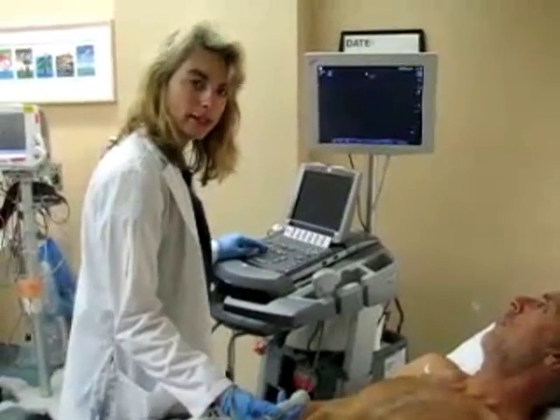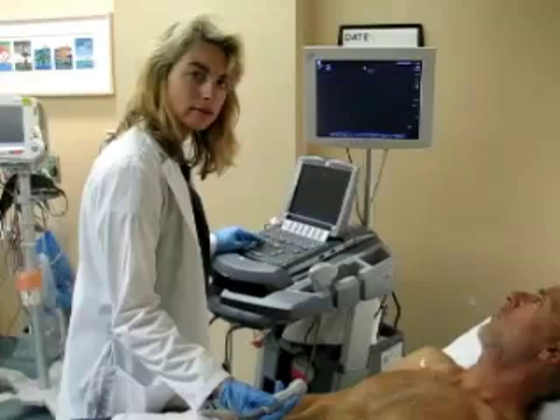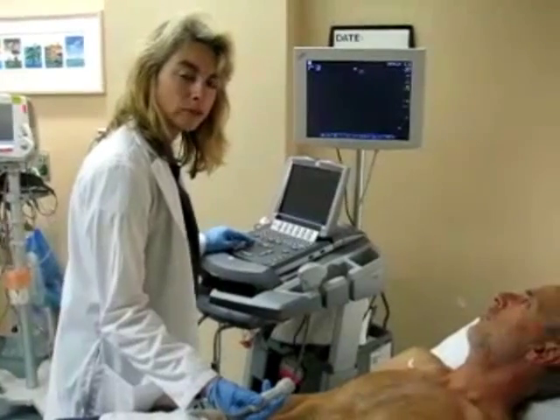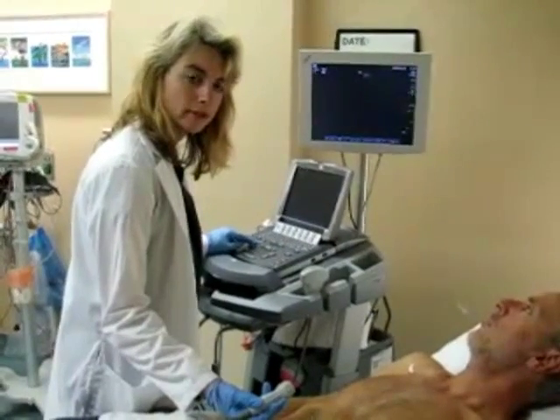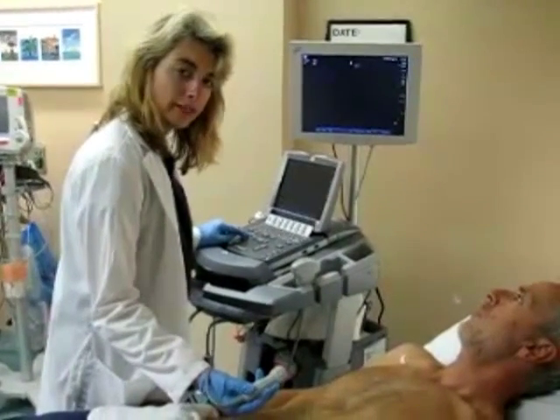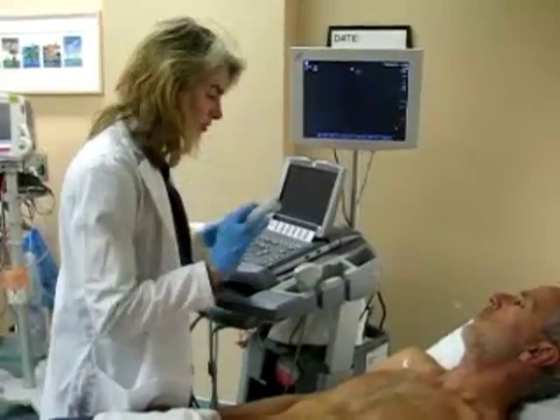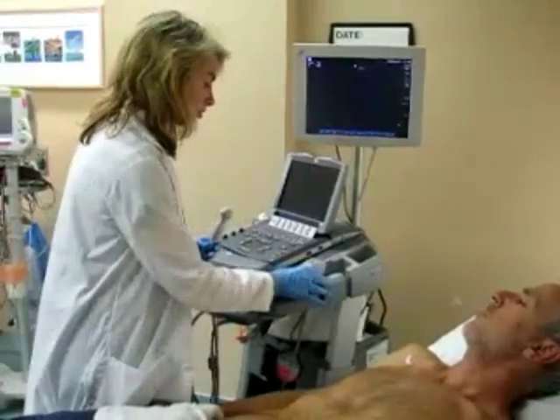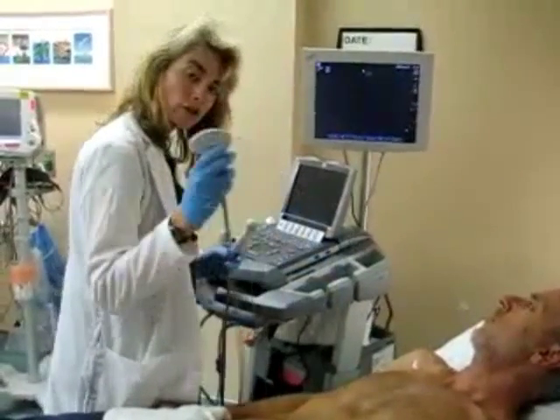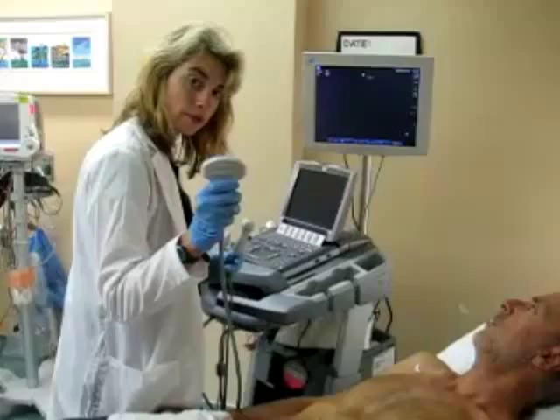Evaluation of the aorta for AAA is a critical ability to have in the emergency department. For that indication, either this probe can be used, or the larger footprint, curved probe, can be used.